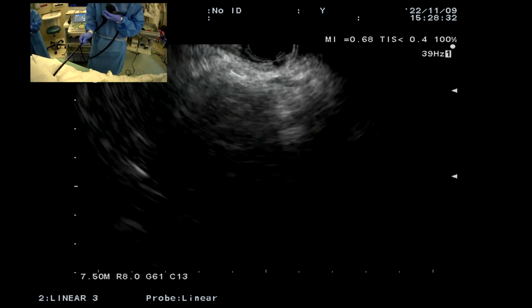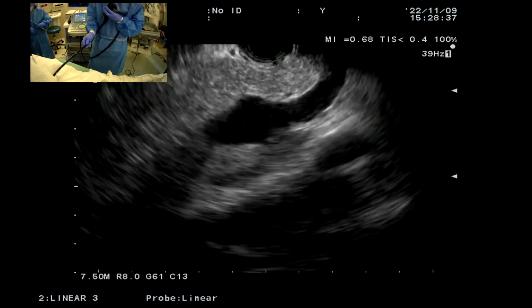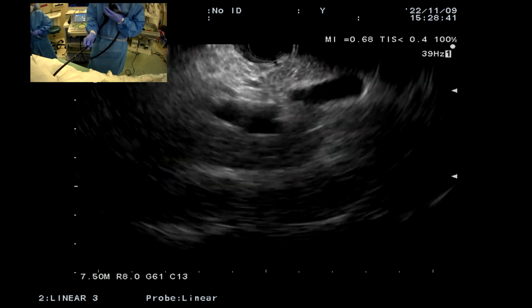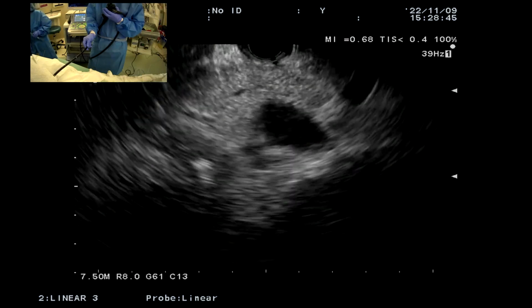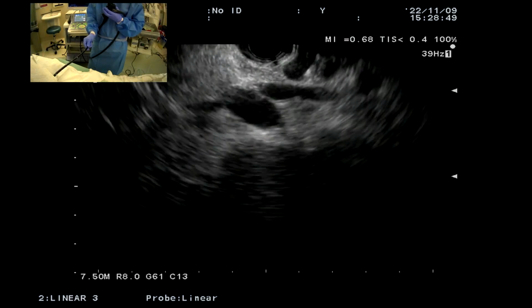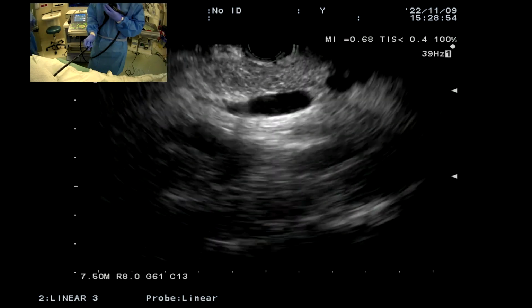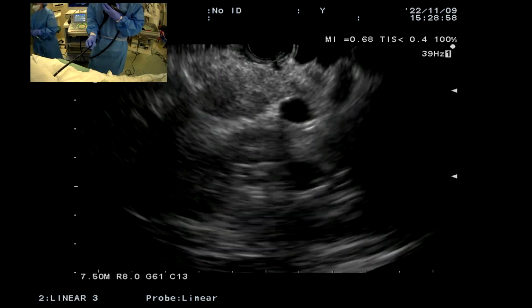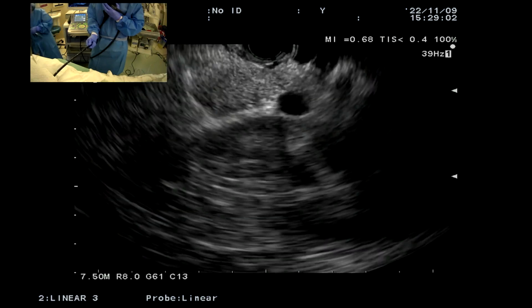Now we're starting to see all these collaterals here. So let's just get a sense as to, here's the confluence again, as we saw from the duodenum, and portal vein going down this way, superior mesenteric artery, we see that. So here's the splenic vein following that below the pancreatic body, towards the tail. There's the kidney now, so we know we're over the tail. Kidney is at 6 o'clock.